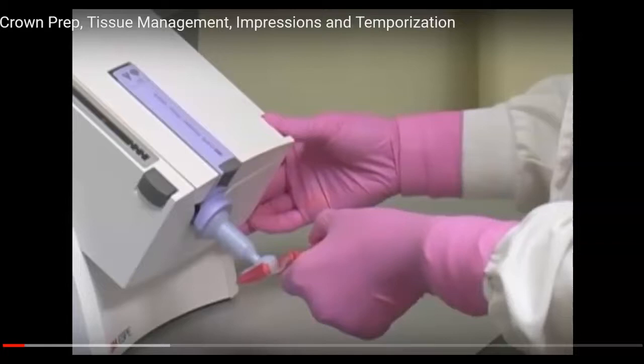With either type that you're using, whether this machine or the extruder gun, you always want to make sure that you dispense a little bit of material ahead of time before you start loading your tray. That ensures that your material is mixed. So you take a piece of gauze, a paper towel, you could put it onto the tray cover, whatever it is, but just dispense a little bit out of the tip first before you start placing it into your tray to ensure that the material has been mixed appropriately, because if it's not mixed, then the material is not going to set up.